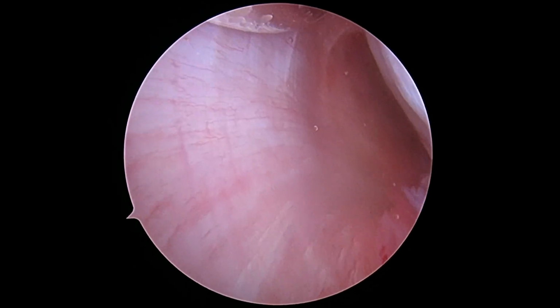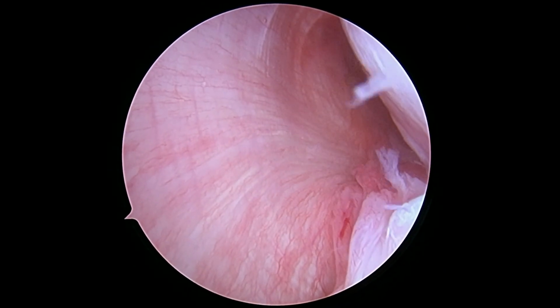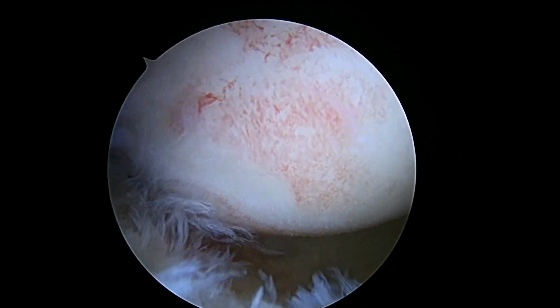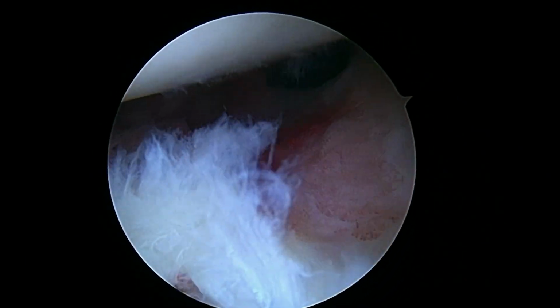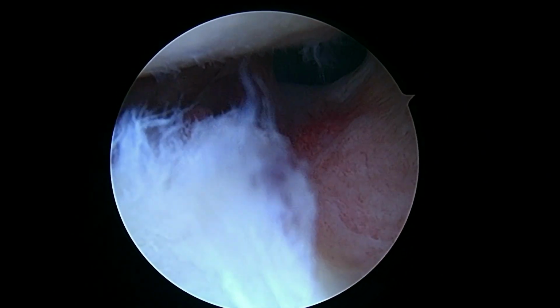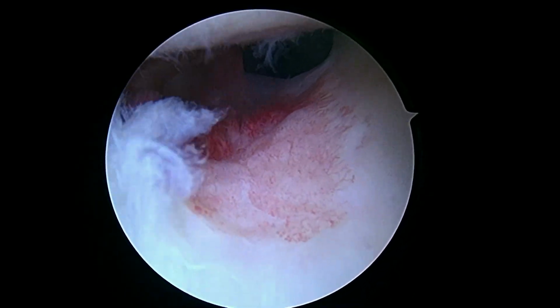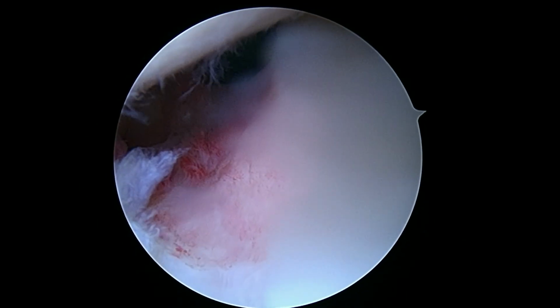This posterior capsule looks good. But the humeral head, you can see how it's kind of irregular. And there's areas here where you've lost essentially all the cartilage on that ball at the top of the screen. So we'll go ahead and plug in the shaver and get it going. Show you some more in a minute.